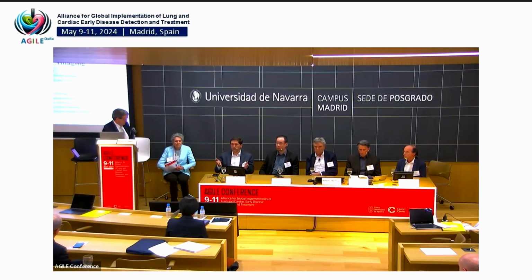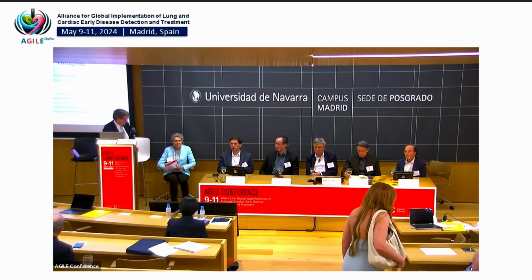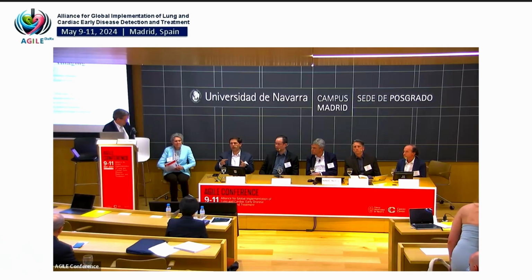But with emphysema, noise is a huge issue. So a bulla or a pocket of air will be minus 1,000. Background lung parenchyma is minus 850 in a healthy person and minus 900 or more, or less, I should say, in somebody who has lung disease of some type.